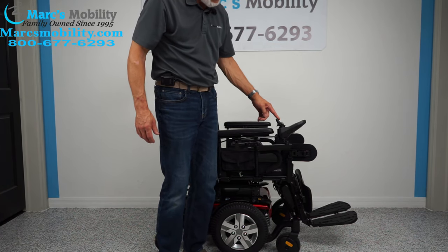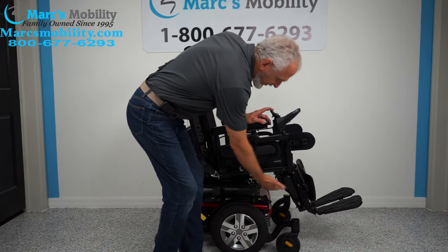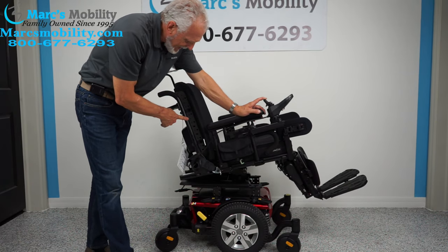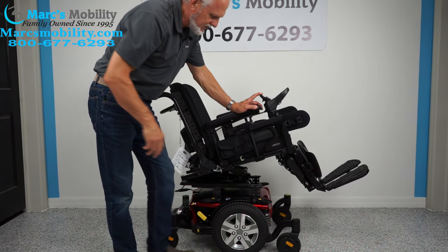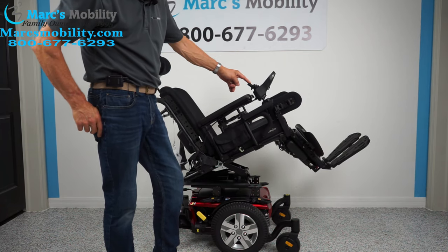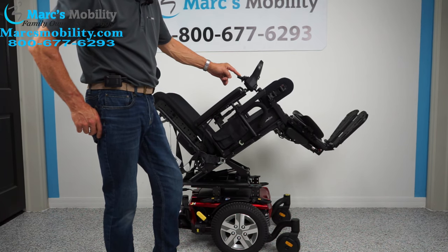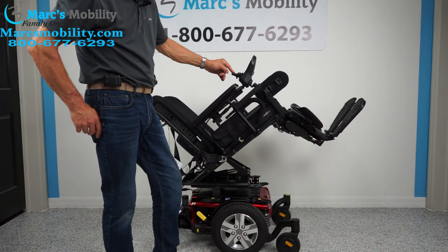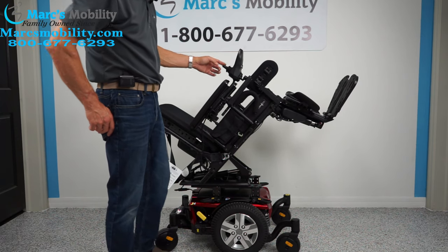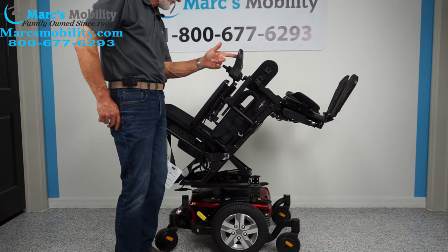I can push the joystick back and there goes what's called the electric tilt. This is the base going back — it's going to take the feet and the back because they're all connected together. This is called the electric tilt. Now we're going to do the feet. I'm going to move the joystick sideways until it's black just on the feet.